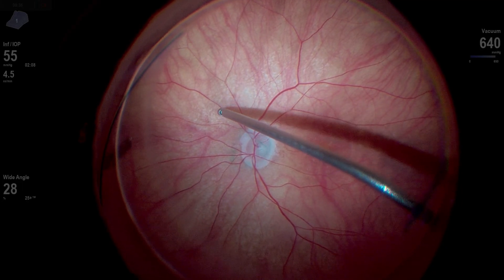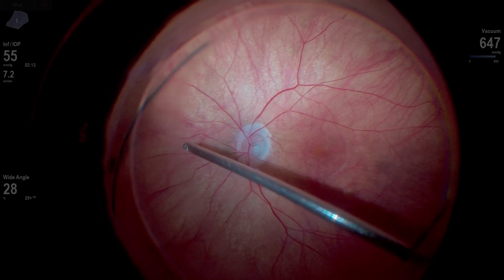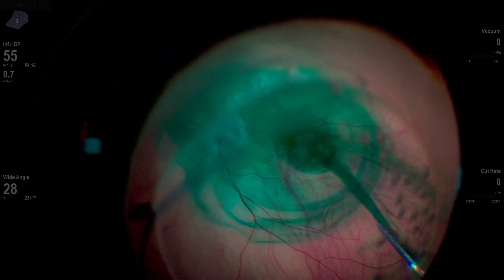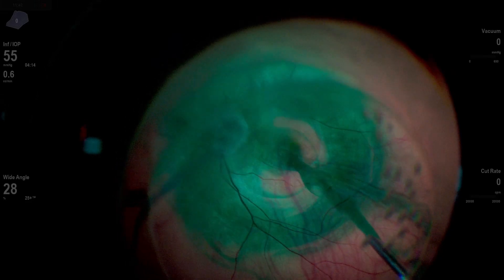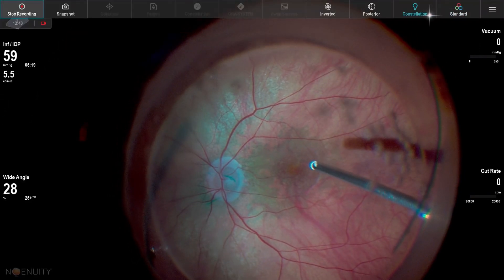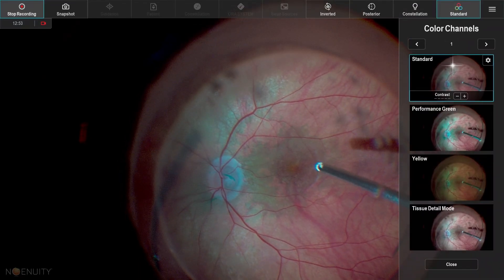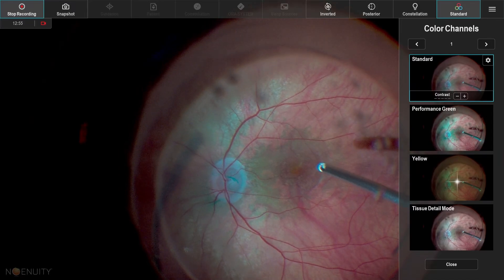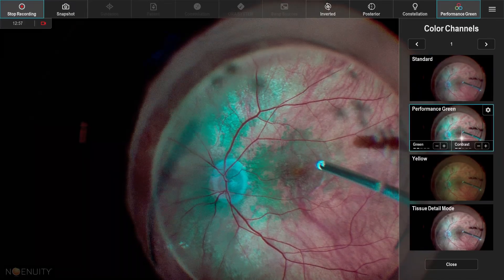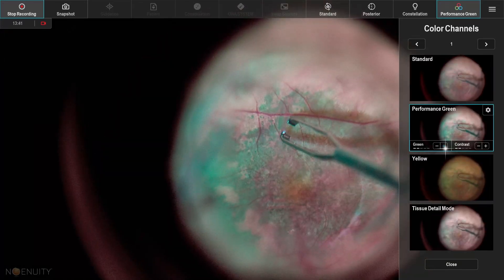And because this patient had vitromacular traction, I want to make sure it hadn't developed into a macular hole. So I'm going to go back in, reapply some ICG, and that allows me to better see my ILM. I'm going to go ahead and just peel this ILM on the off chance that there might've been a small something there, and to make sure I've gotten rid of any epiretinal membrane formation that can sometimes occur in these patients with VMT and a partial macular separation.